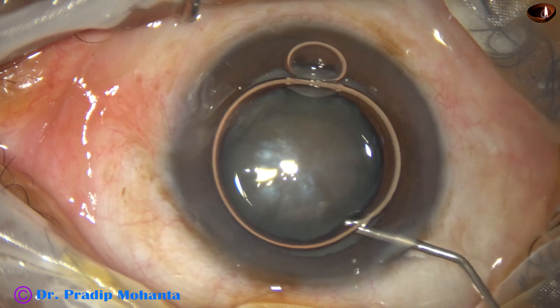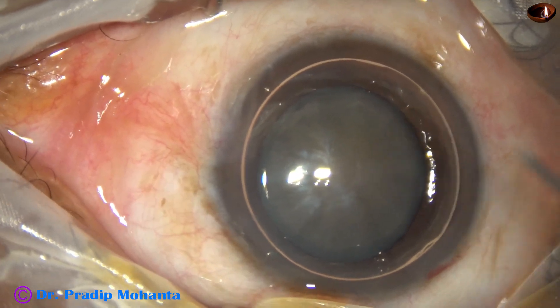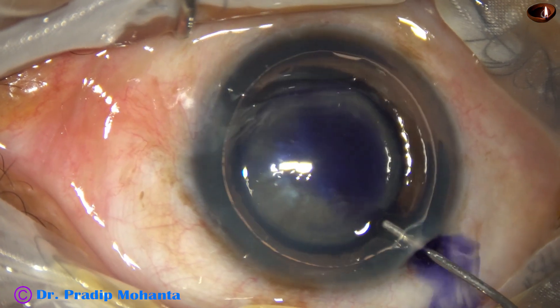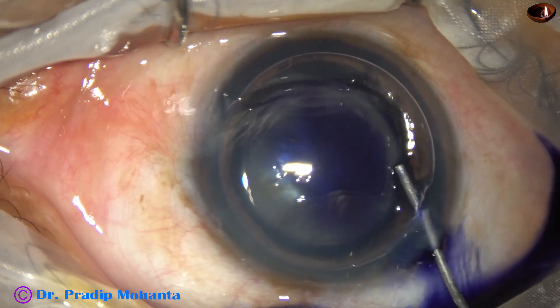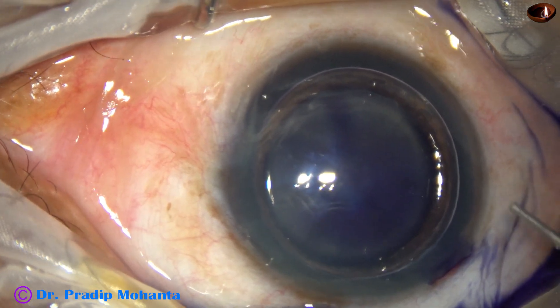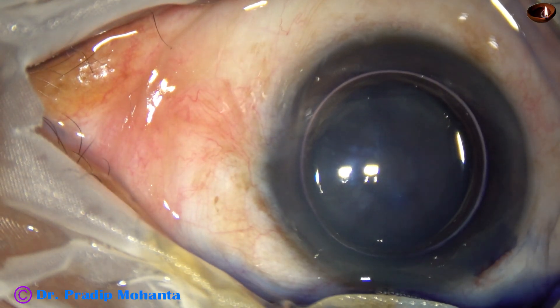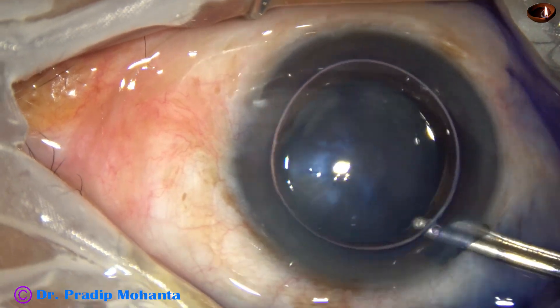This is an air bubble filling up the anterior chamber. Beneath this air bubble, trypan blue dye is used to stain the anterior capsule. The dye must touch all parts of the anterior capsule. This is adrenaline and now the dye is washed out.